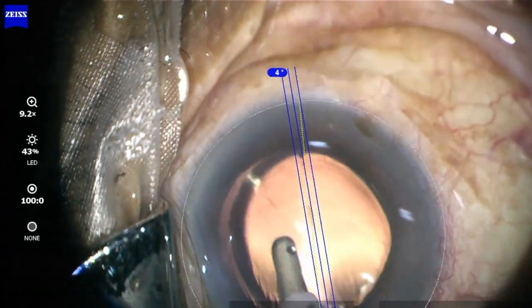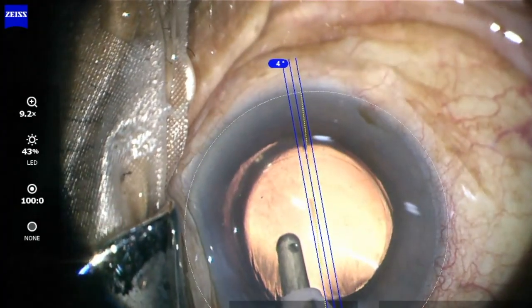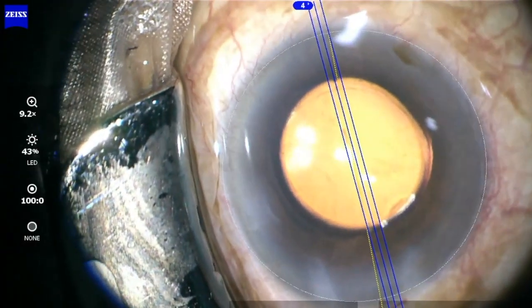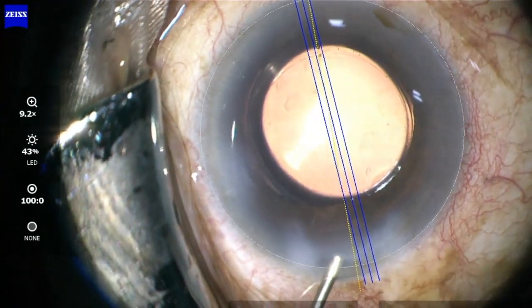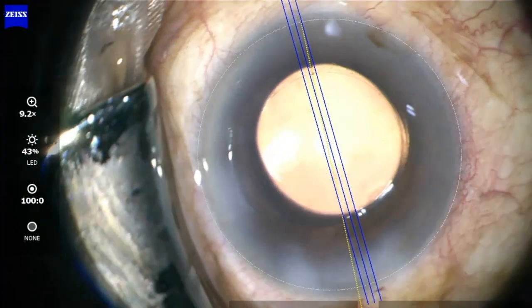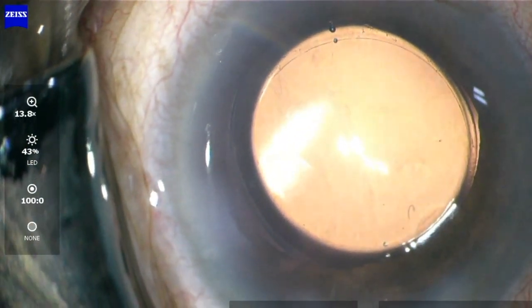or to the overlay of a markerless system, without worrying about the pupil becoming small — because you are actually aligning the central mark and not the peripheral marks to the overlay, which get usually hidden when the pupil becomes small.